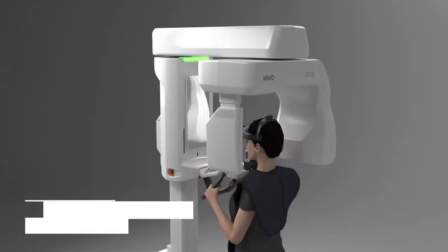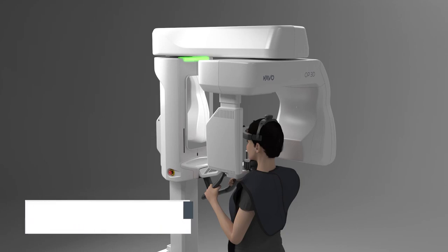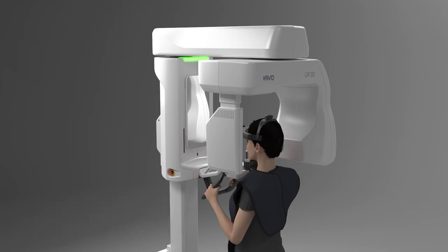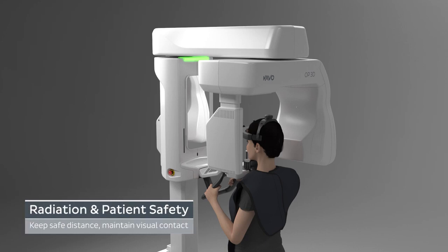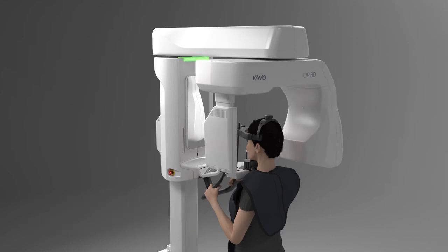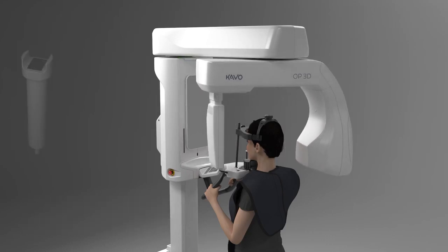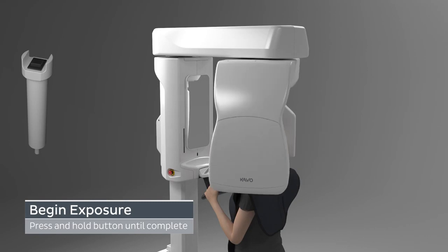Inform the patient that the machine will rotate around their head and an audible sound will occur. Protect yourself from radiation in accordance with local safety guidelines and regulations while maintaining visual contact with the patient during exposure. Press and hold down the exposure button until the process completes.